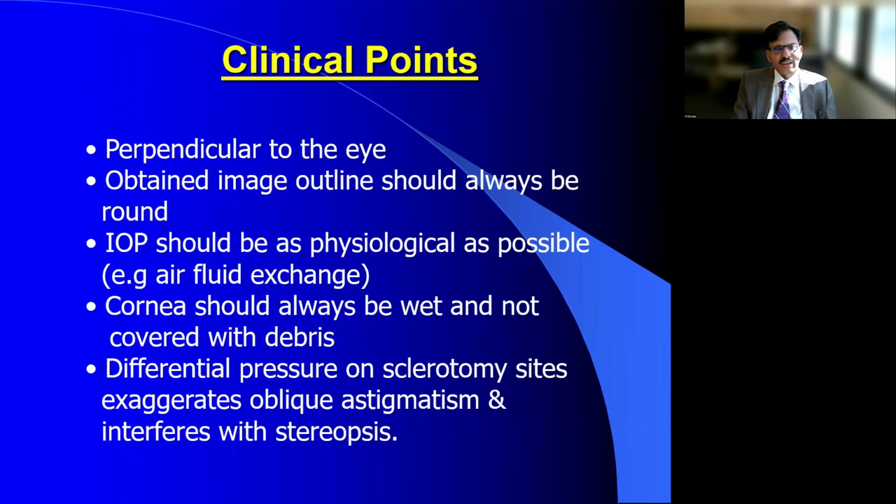Or if you are low, you can have DM folds, which can mess up your image. So always try to maintain an intraocular pressure between 15 and 25, which is equivalent to, if you're using just a pole, 40 centimeters of water above your operating room. But with the various vitrectomy systems now trying to control the pressure, the limitation, of course, is you have to use closed ports. If you have open ports, they're not really accurate. So this is really important if it is a long surgery, to keep your cornea clear.